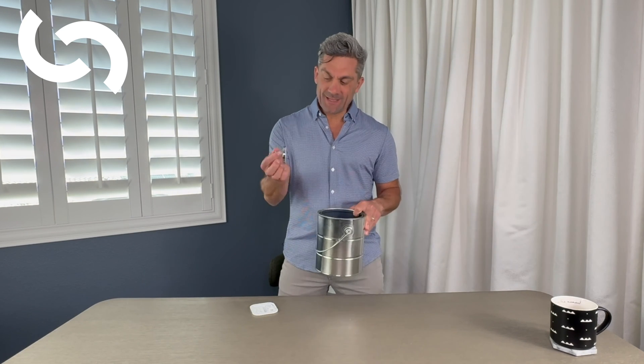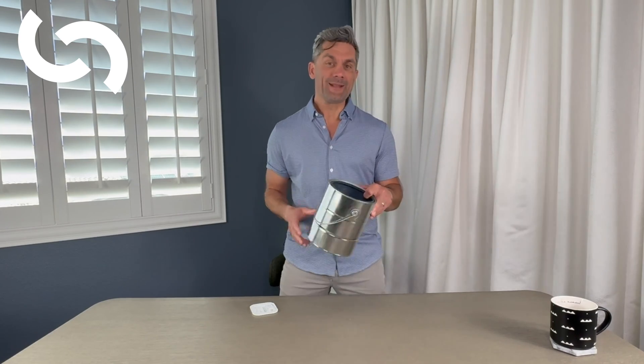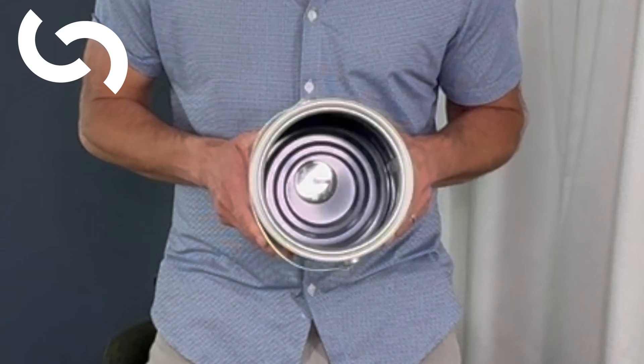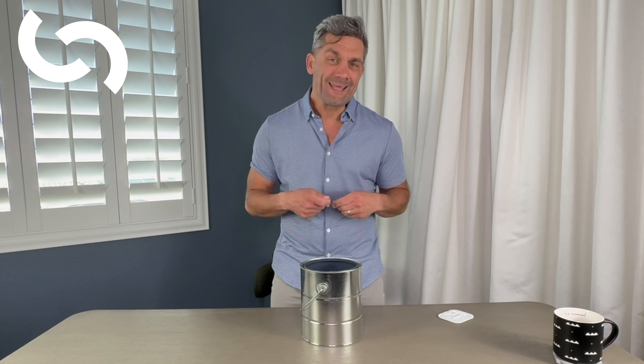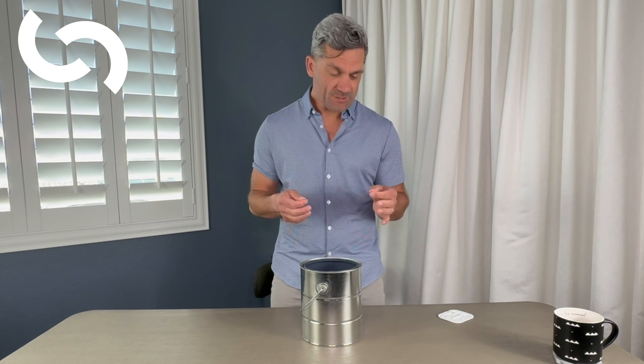So how do we set this up? You take your empty paint can and just take this magnetic hook and pop it right down to the bottom. This is going to give you a great instrument for practicing your ties. We have a 3-0 silk suture — this is a 30-inch long suture. It's important to have the right length of suture when we do deep ties. We don't want to get stuck with a short suture and really struggle to get that knot thrown. Give yourself plenty of length.